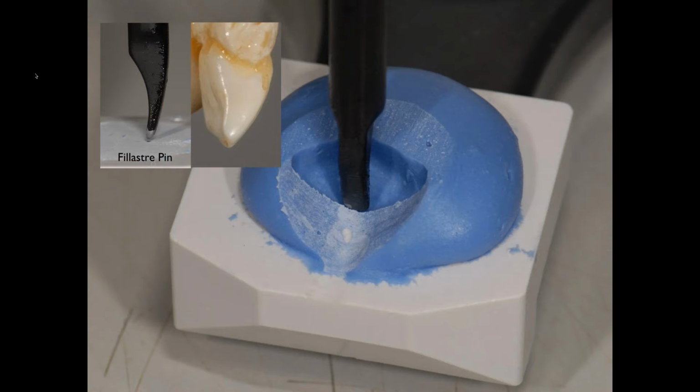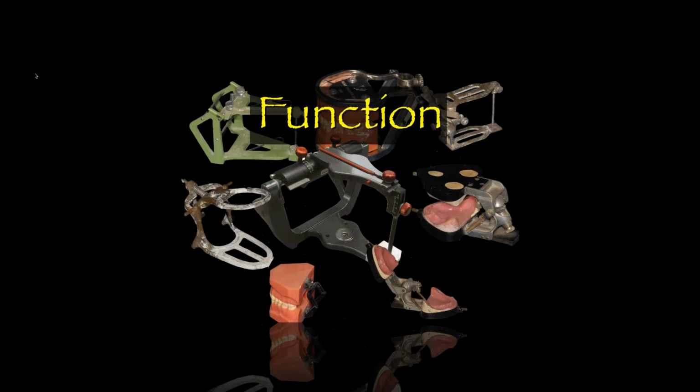And what's interesting is that when we found the shape that actually worked well, it mimicked the shape of a maxillary incisor. Kind of interesting, but makes sense. So I would say you should have a pin like this before you try to make guide tables if you want them to be accurate, and they need to be accurate.